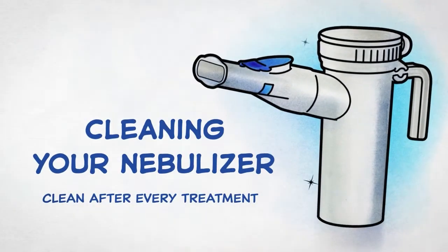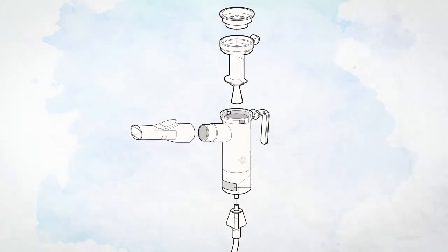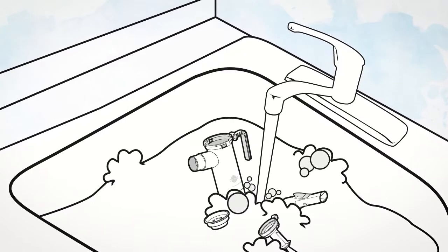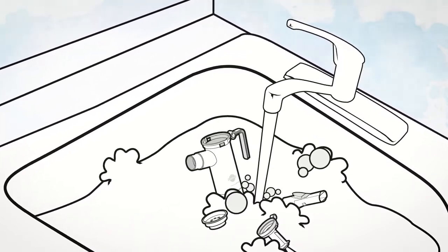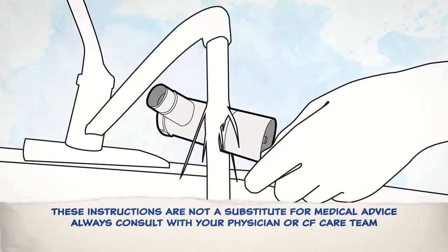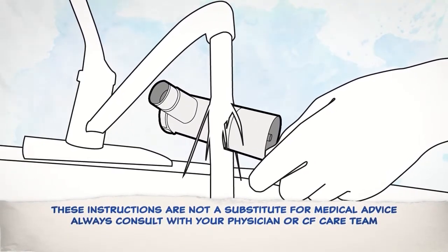Cleaning your PARI Reusable Nebulizer: Disassemble reusable nebulizer parts as illustrated here. Wash all parts with warm water and liquid dish soap. Please do not wash the tubing. Rinse the reusable nebulizer parts thoroughly with warm water and shake to remove excess water.